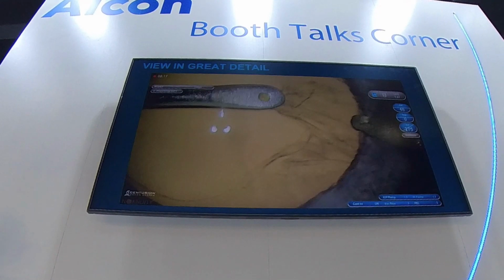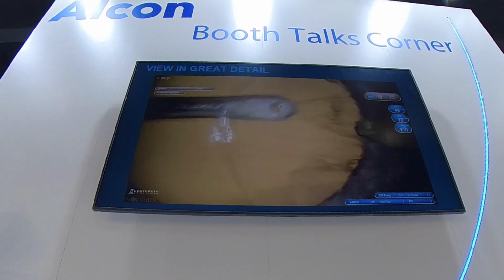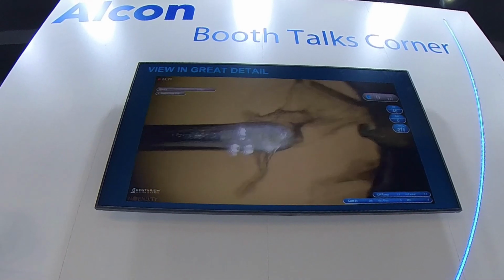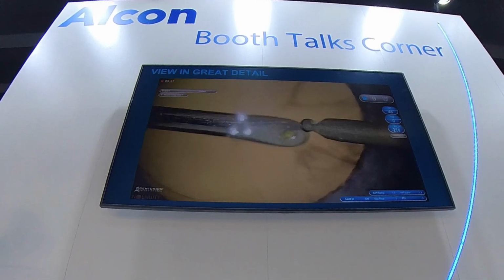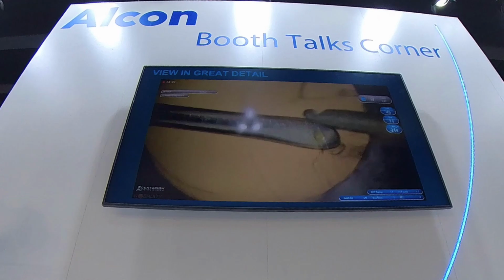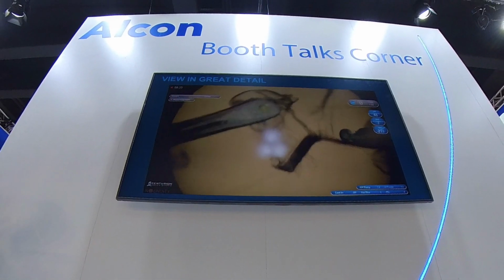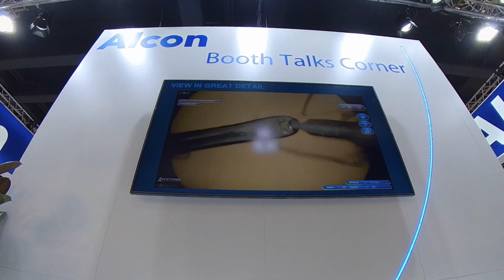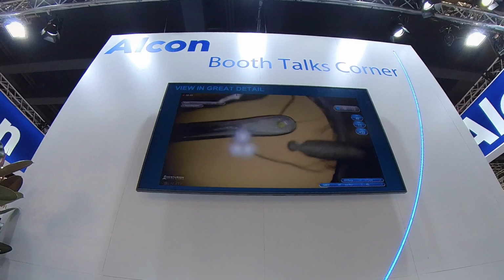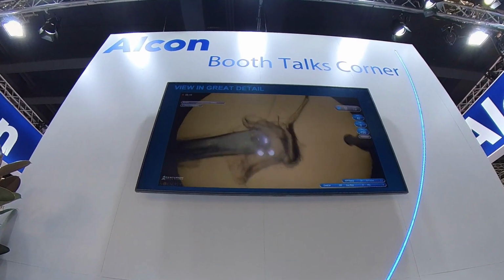Another thing: zoom, magnify, and have a good resolution. Here, this is a microscope Lumera with Ngenuity, and the microscope is near the maximum magnification. You can see the thickness and the texture of the instrument, and you can also see the cortex, and you can appreciate the image quality of that. You see the opening of the instrument, everything is in focus.